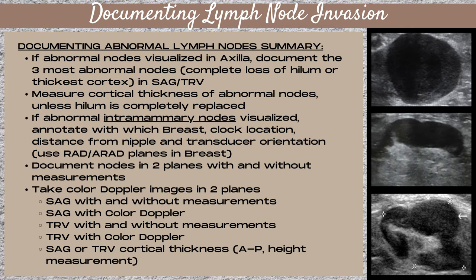For abnormal intramammary nodes — nodes within the breast — annotate with which breast (right or left), the clock location, the distance from the nipple, and the transducer orientation, and use radial and anti-radial planes. Otherwise, follow the same protocol as axillary lymph nodes: two planes with and without measurements, color Doppler in both planes. The sequence is: sagittal with and without measurements, sagittal with color Doppler, transverse with and without measurements, transverse with color Doppler, then a cortical thickness measurement — the AP, anterior-posterior or height measurement — in either plane.